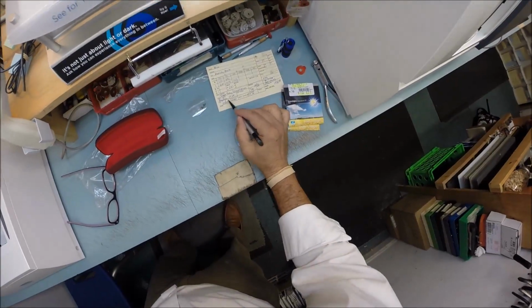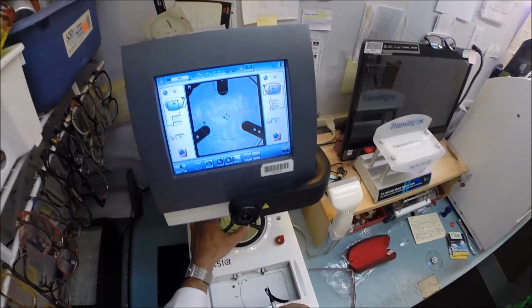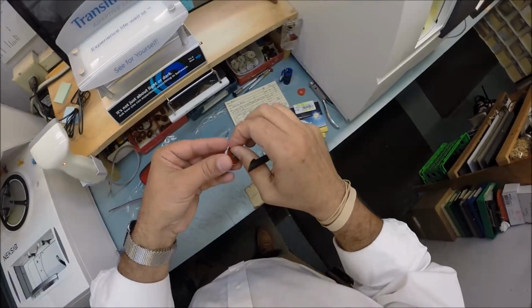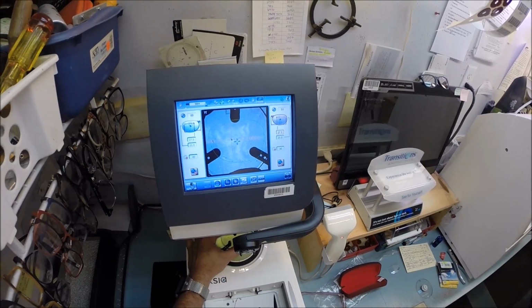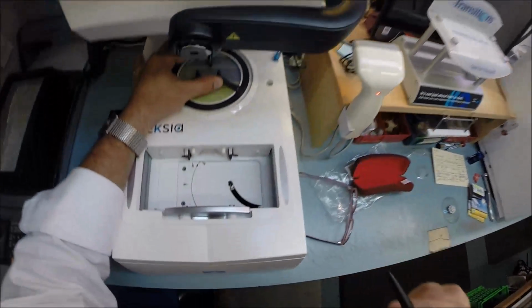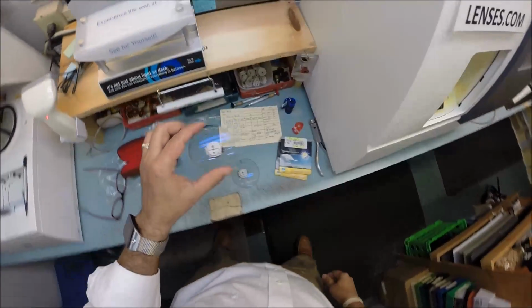Same pupillary distance, 27.20. What do you know? 27.20. That was convenient. So get those 2 dots lined up in there just right. And, oh, almost forgot the block. Pull the sticker off to make the black side sticky. Sticky like syrup. So, let's see. Those 2 dots are lined up, 27.20. Hit the button. The arm comes down and places the block onto the left lens.